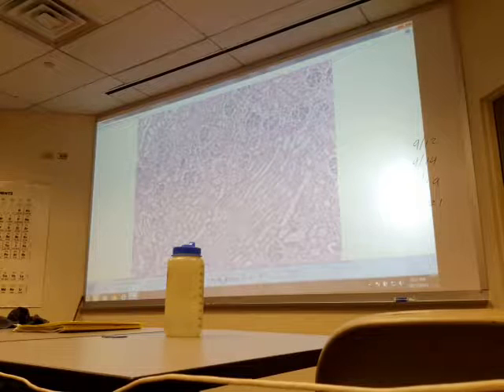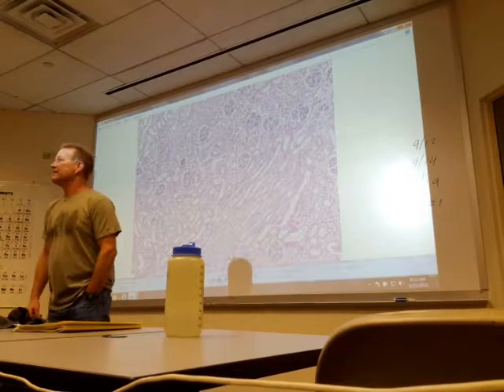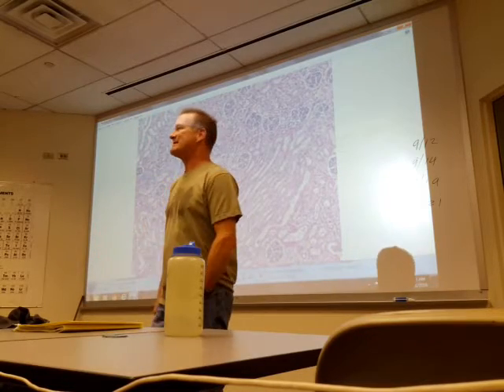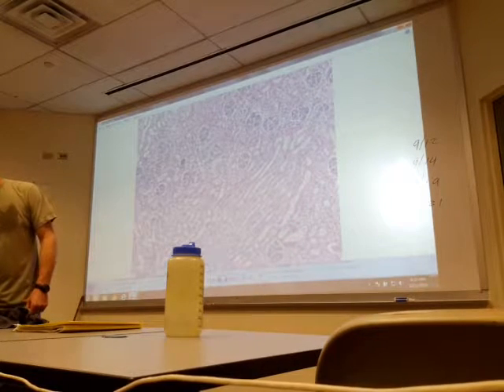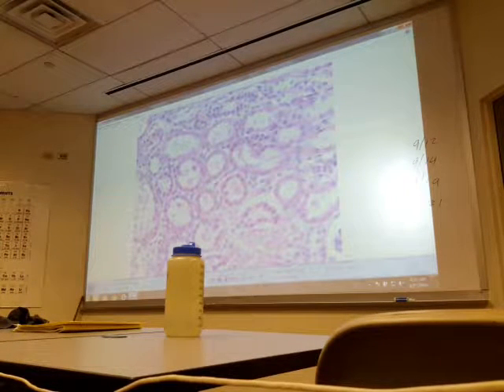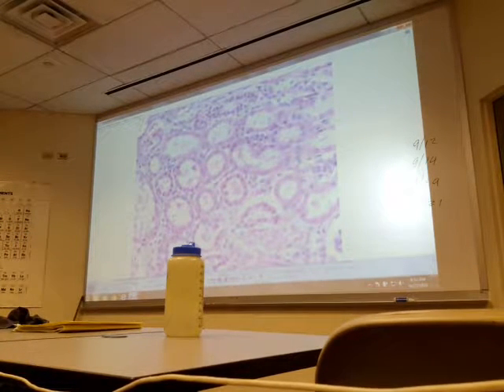And okay, I know there are kidney tubules in there, there are renal corpuscles in there, the corpuscles are divided into Bowman's capsule and a glomerulus. They're both made of simple squamous. The glomerulus function is diffusion. Bowman's capsule is filtration. The tubules function is... all that's racing through your brain. And so when I get to a higher magnification picture, like maybe this one, you already know it's kidney. And now you know immediately those are the tubules, and you know they're made of simple cuboidal, and the function is selective reabsorption.